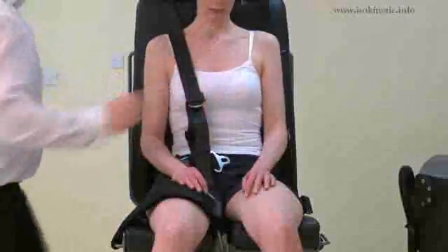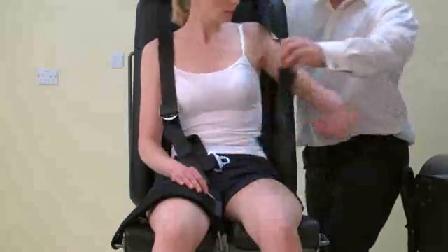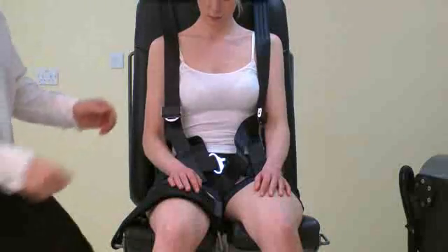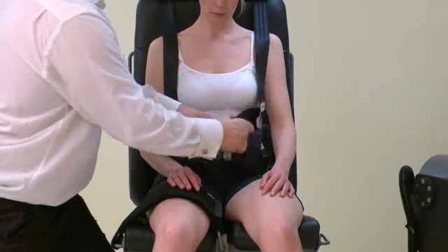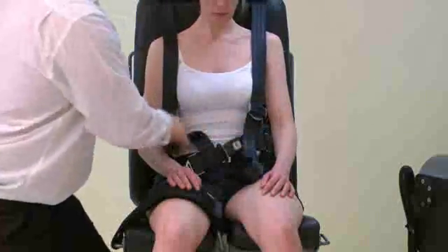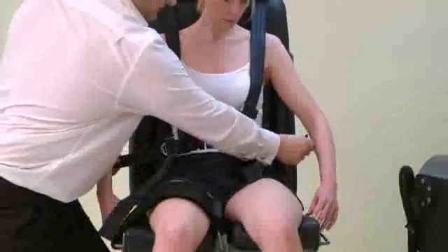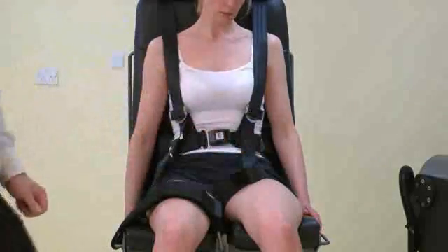Finally, attach the shoulder straps if required. To use the chest straps, first place both arms through the loops. Then clip the straps together using the clasp. Tighten the upper straps until the waist sections are above belt level. Now tighten the waist straps, keeping the clasp centrally on the waist.